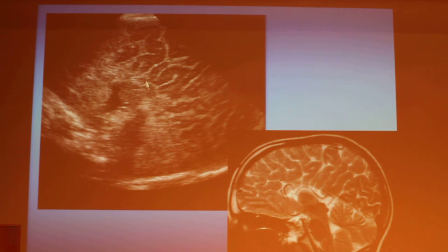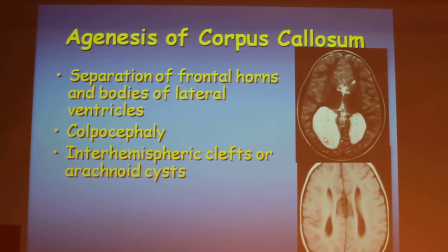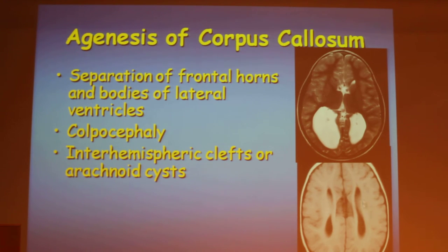There is no corpus callosum or cingulate gyrus in the midline. Off-midline sagittal imaging will show us hydrocephalus and mainly colpocephaly. On axial imaging, colpocephaly is a sign for agenesis of corpus callosum, and the lateral ventricles are parallel.